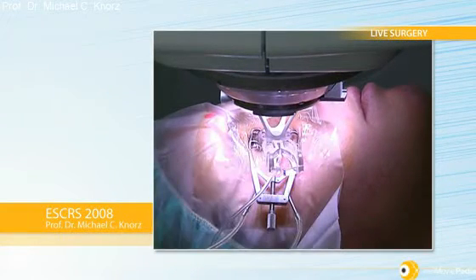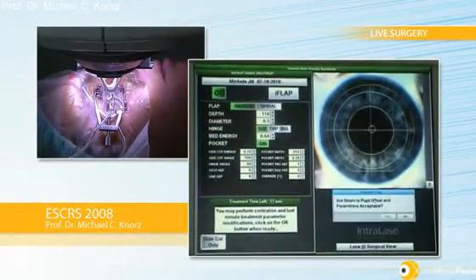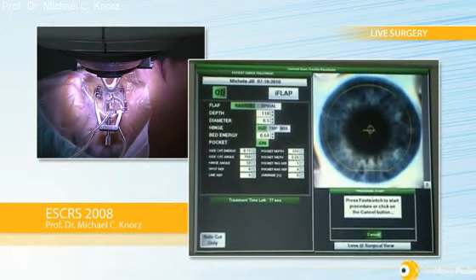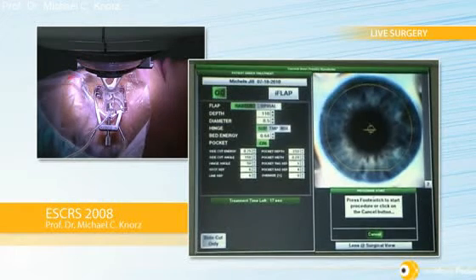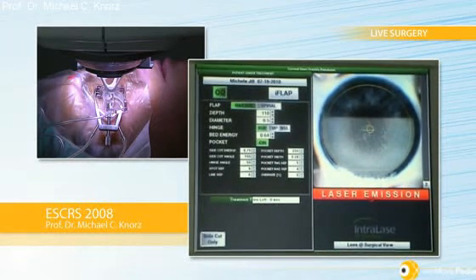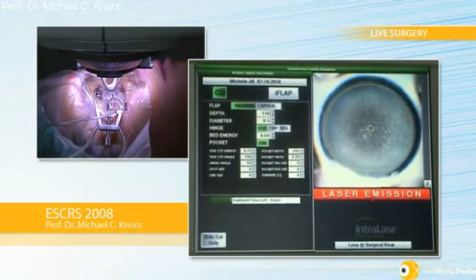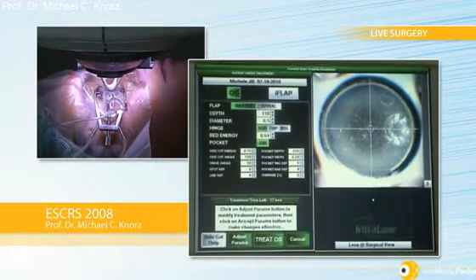Then we will center using the software. Now we have perfect centration — this is a 150 degree side cut, and we are using a side cut energy of 0.75. It's a 110 micron flap. You can see the wonderful meniscus here, with only very, very few OBLs forming at the very periphery because the pocket works very well. This is just the perfect setup. The ablation just touches the meniscus and we get almost no OBLs in the bed at all.